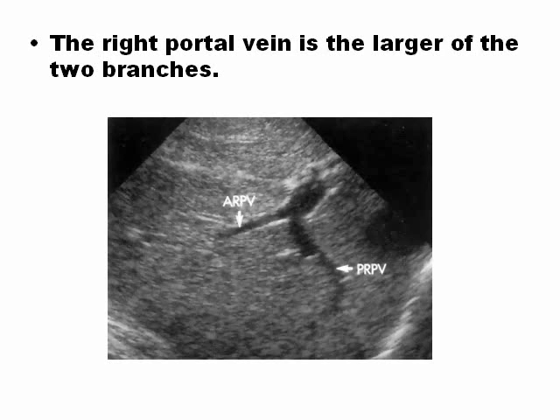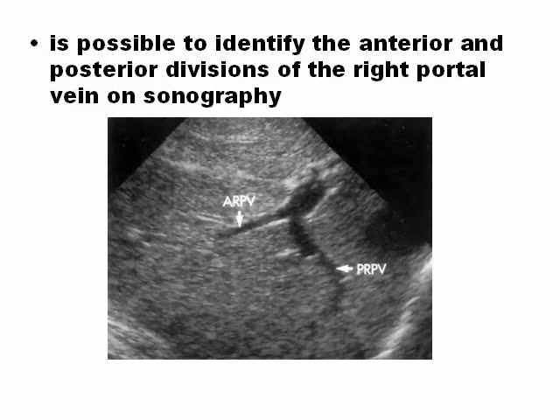The right portal vein is the largest of the two branches, because the right lobe is the bigger lobe. It is possible to identify the anterior and posterior division of the right portal vein on sonography, along with the right hepatic vein.